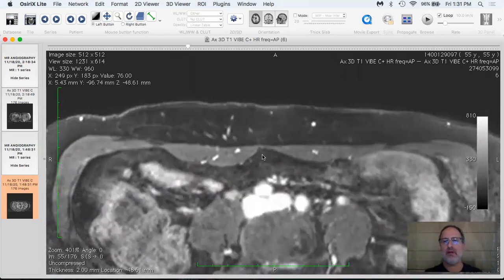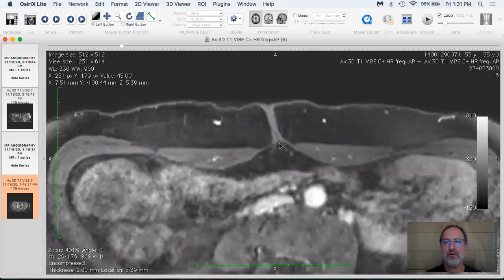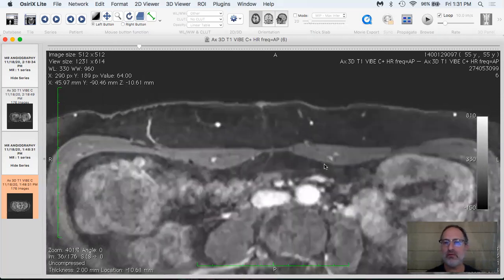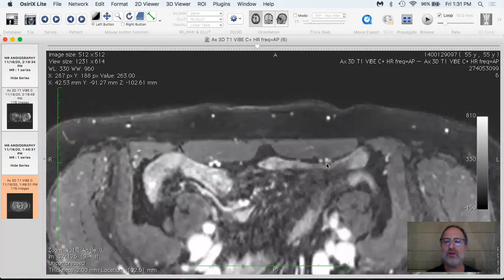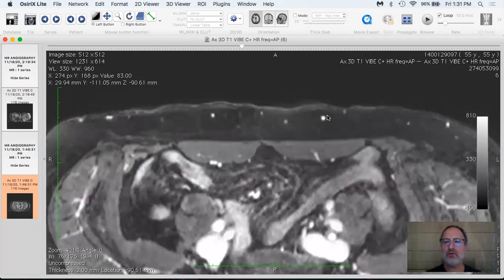Of course, this is the midline here, and you can remember that we started out at the belly button. This is the fascia in between the two rectus muscles. So there's actually also a deep inferior epigastric on this side, which we can easily find. But it's not as big as the one on the other side, as you can see. And so the perforators are a little bit smaller. This side was also used as a deep inferior epigastric perforator flap for breast reconstruction.